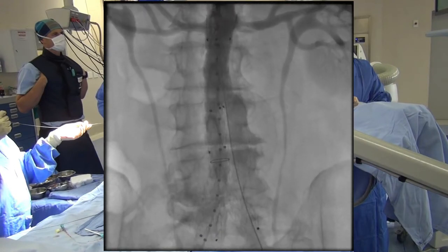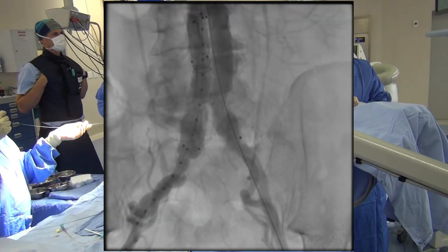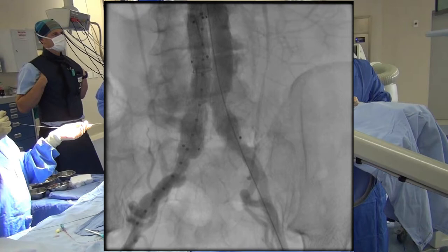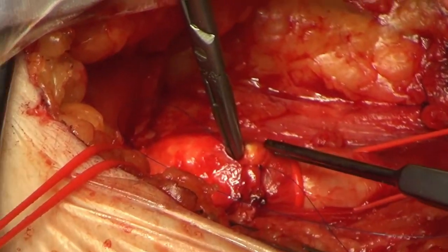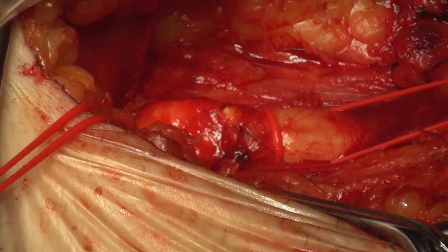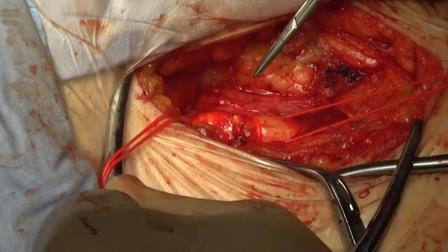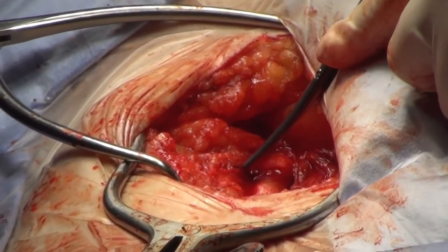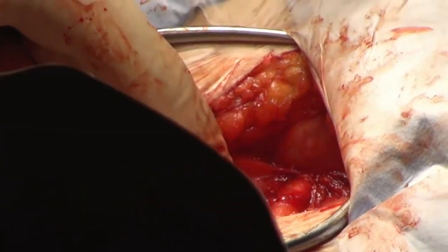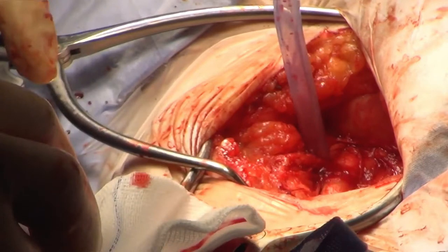This image demonstrates the completed procedure with successful exclusion of the abdominal aortic aneurysm by the stent graft. After the delivery devices, balloon catheters, and wires have been removed, interrupted non-absorbable sutures are placed in the femoral artery to close the defect created by the deployment system. After the sutures have been placed, the clamps are removed to confirm hemostasis. When there is no active bleeding, the wound can be closed.